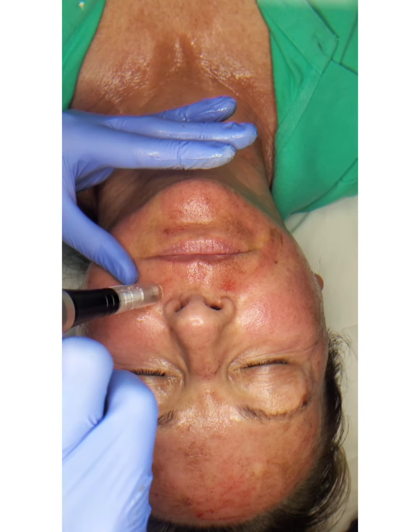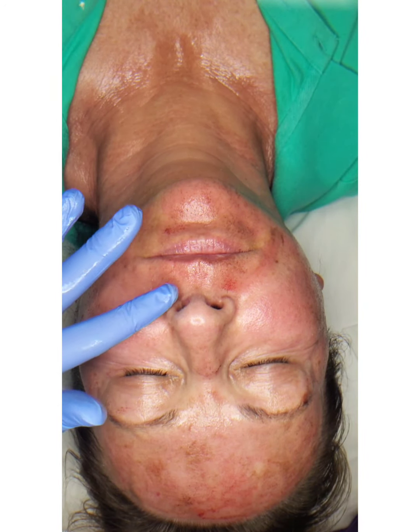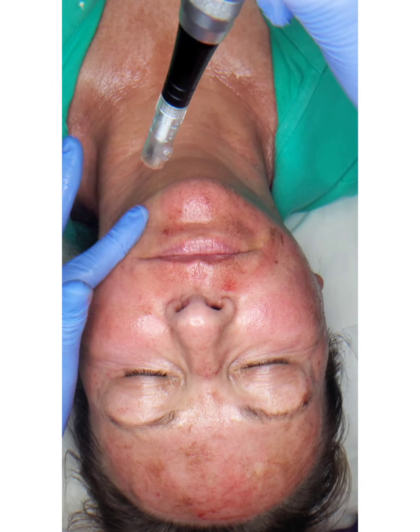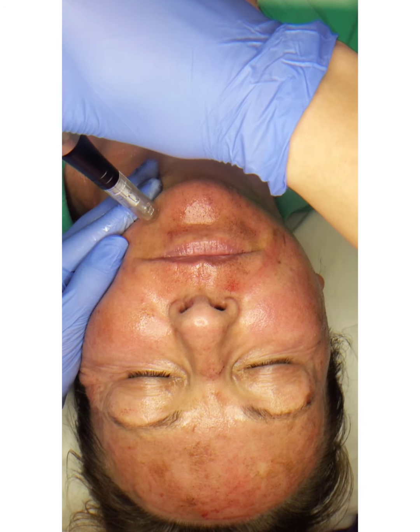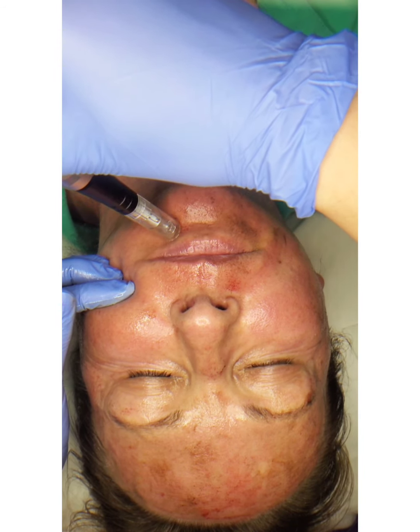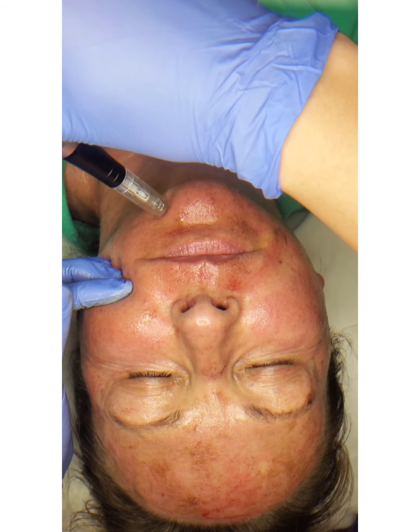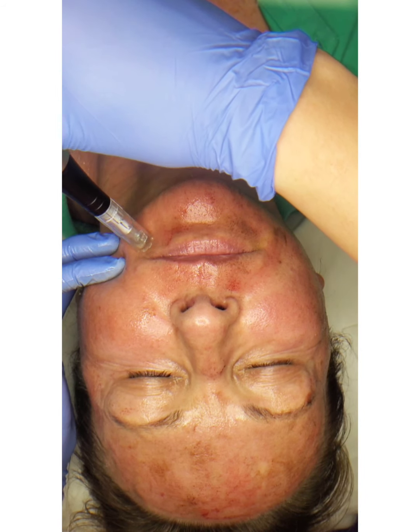Really like to get really close to the lips. I even have some patients who request that I do the lips. Now that does not feel wonderful when I do right on the lips, even with numbing, and it can swell them up quite a bit temporarily. So not everyone wants that, but I do like to get extremely close to the lip line, because people do get a lot of fine lines and deep wrinkles in that area at some point in their life.